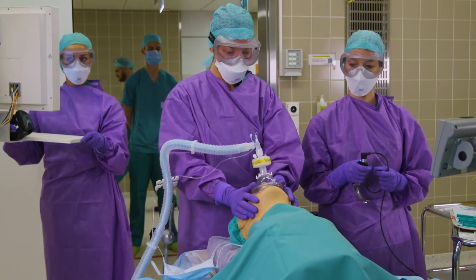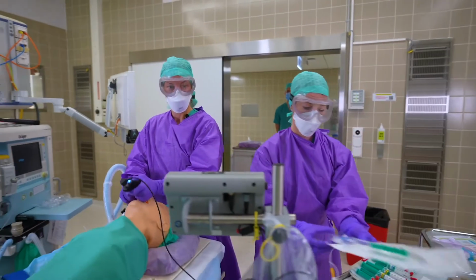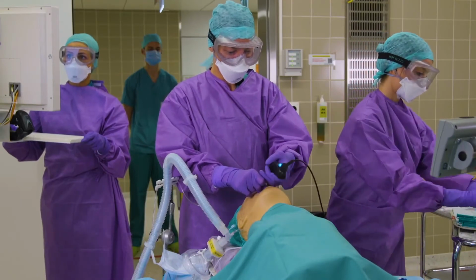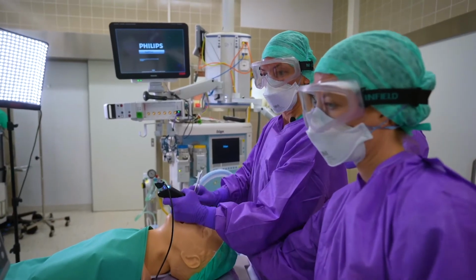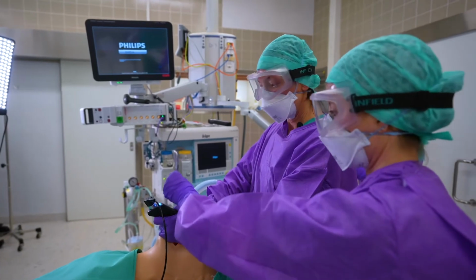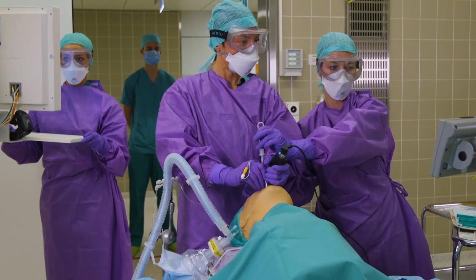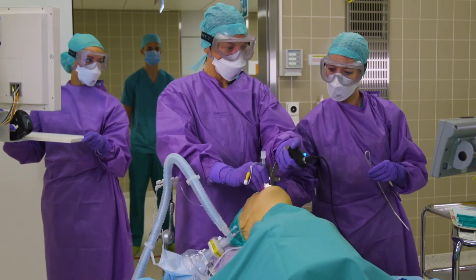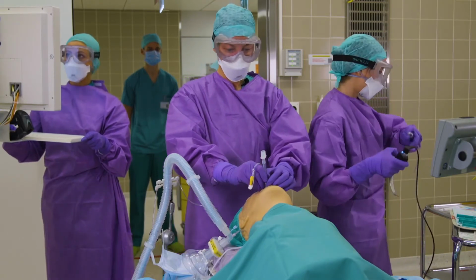We are now intubating the patient with a video laryngoscope. We are utilizing an endotracheal tube with a stylet in place. The endotracheal tube now is in place. The stylet can go. Thank you. It's important to inflate the cuff before ventilating the patient.